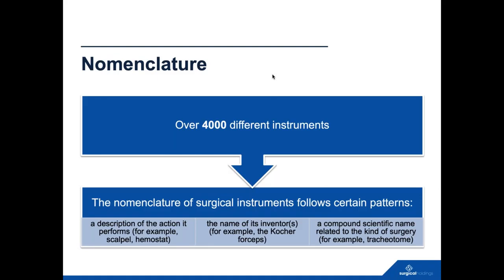Yeah, that tape, as you mentioned, may serve a purpose in terms of identifying an instrument, but we handle a lot of repairs, and some of the debris that we see under the tape when it's removed just doesn't really bear thinking about. So I think time spent on education and trying to learn some of the devices is worthwhile, which you will pick up if you're handling trays every day. There are probably 30% of the tray that are going to be on every single tray, bar some of the specialities, so you do then get familiar with those names.